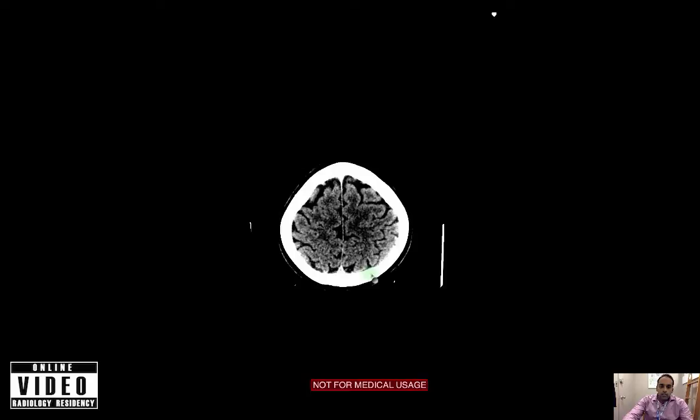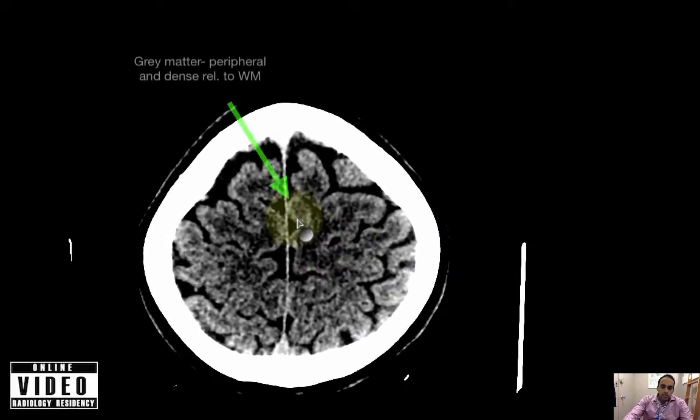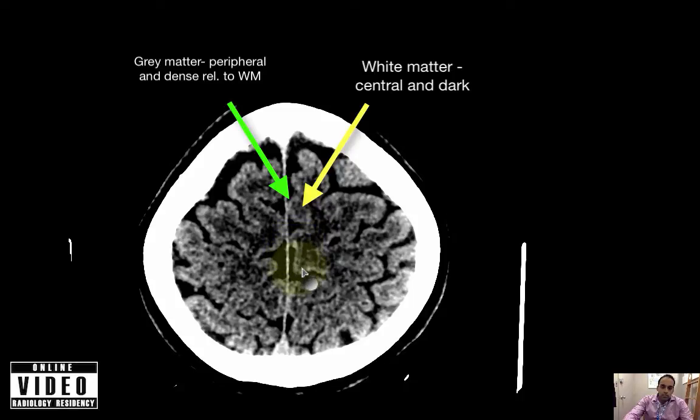Here at the high cortex you can note a distinction between the gray matter on the periphery of the gyrus and the white matter beneath it. Importantly, in the early stage of an ischemic stroke, you're going to see loss of that gray-white distinction.